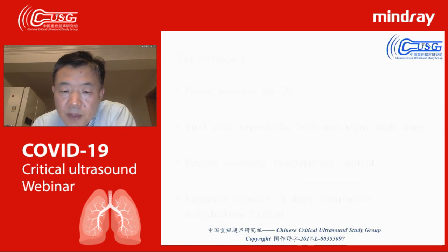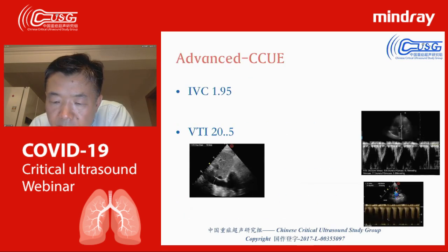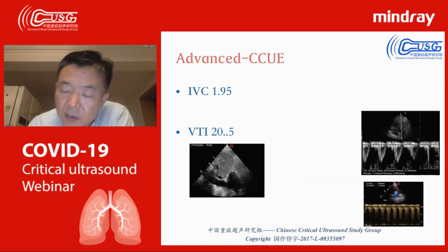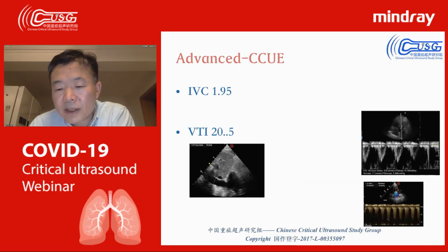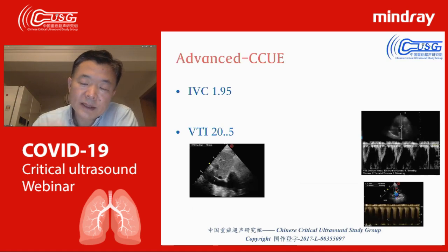And also in this part, here, we see the patient's cross tricuspid valve pressure is 51 millimeters of mercury. That means the patient's pulmonary artery pressure is more than 60 millimeters of mercury. That is a very high pressure. So I think when we put this information together, the patient's right heart function is now compromised. So we try to give some kind of interventions.